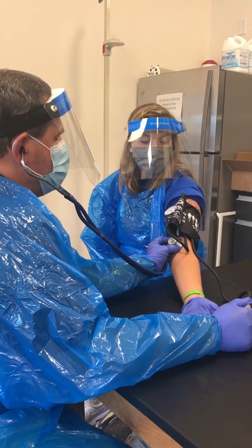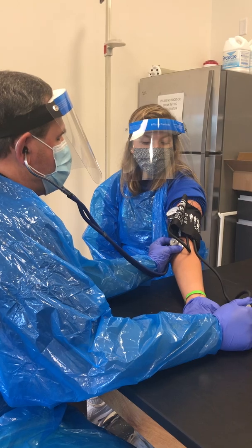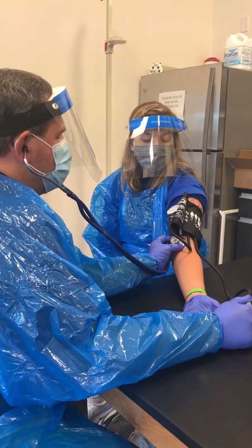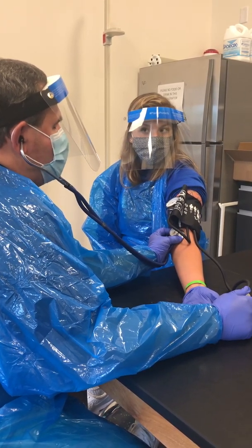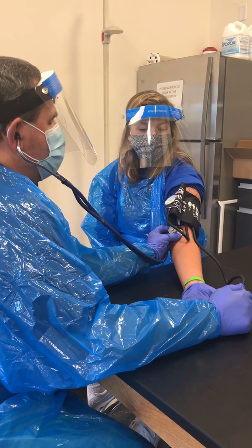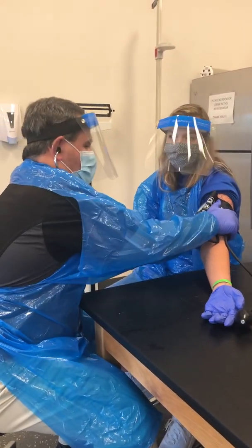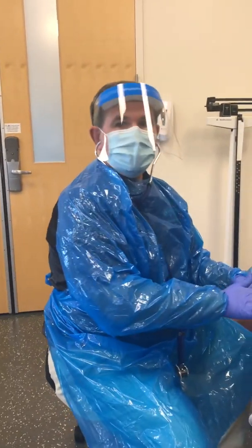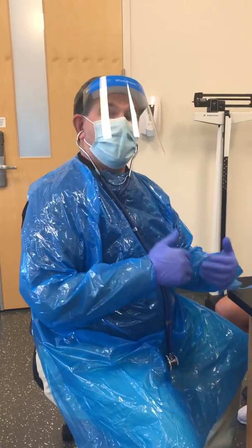Continuing to lower pressure until I have the disappearance of sound for the 5th Korotkoff sound. Once I lose that sound, I'm going to keep deflating at a nice steady rate. Make sure that I open the valve altogether and press all of the air out of the cuff. At this point in time, her blood pressure is at 116/68. We can never take an odd reading.